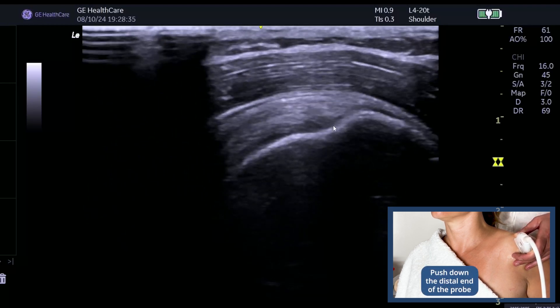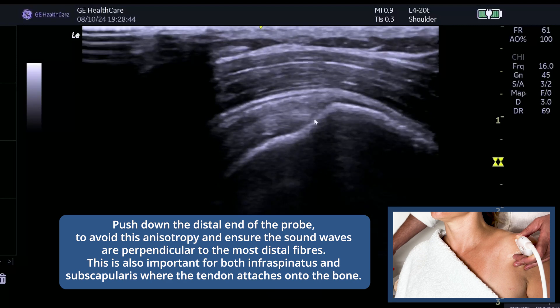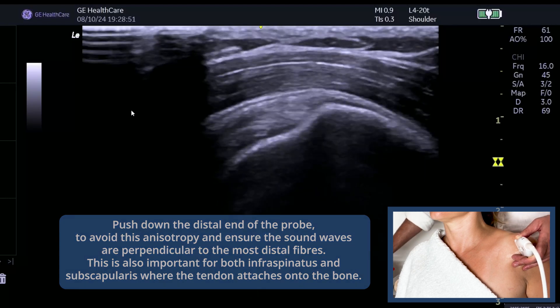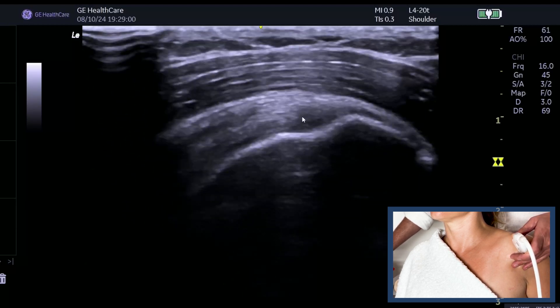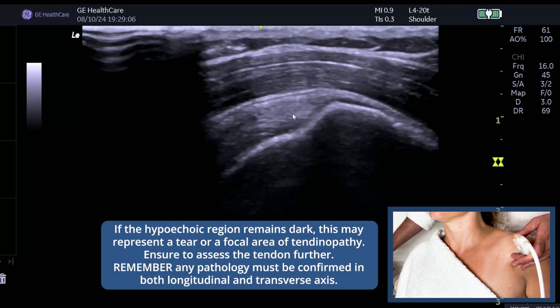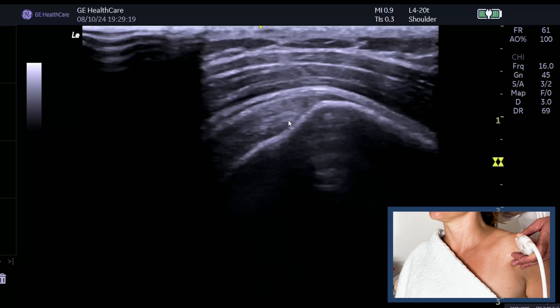Heel down to see whether that is anisotropy or whether it's a tear or tendinopathy. As soon as I really push down the heel of the probe, you can see those last fibers going into the greater tuberosity. I'm sacrificing this side of the image — I don't worry about that because I just want to know about these fibers. So the tip is: if you see any dark patches, make sure you heel down. You can now tell that's anisotropy because you've got the probe parallel to the fibers, the beam perpendicular, and you can see those fibers going into the greater tuberosity. So make sure you're using your heel and your toe.